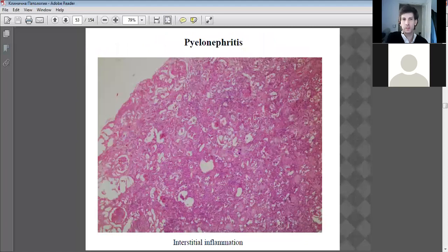I can see the breakdown. You can see the edge is all rough. Lots of holes. Looking on the slide, about one fairly normal glomerulus. The rest are finished. They're sort of non-functional. Huge holes, lumens forming. It's peppered with all these holes.